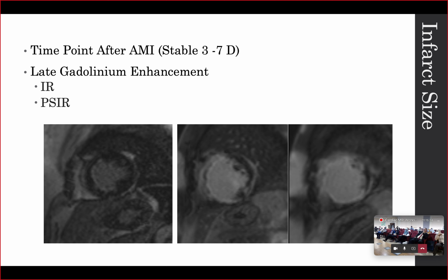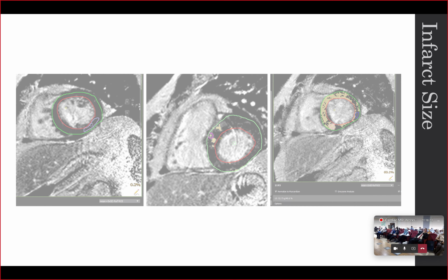Infarct size, whether it's subendocardial or transmural, is very important to mention, as is how big the territory affected is. Is it mid? Is it apical? Is it basal to apical? So far, the assessment is with inversion recovery or PSIR in order to assess the infarction size.